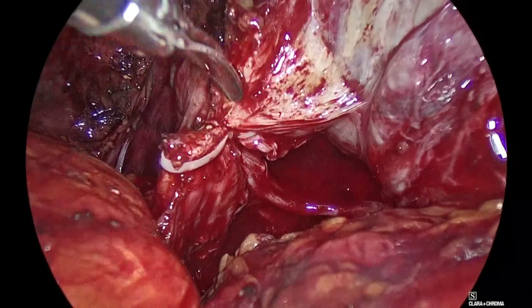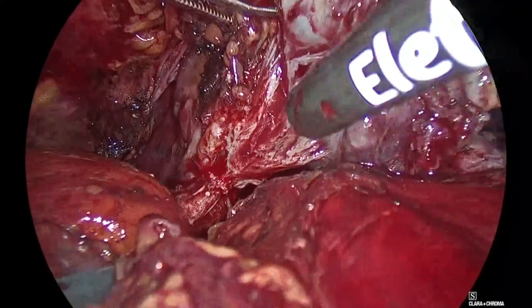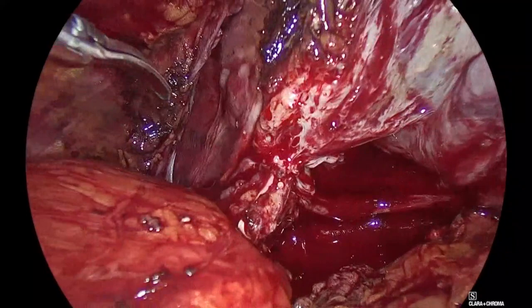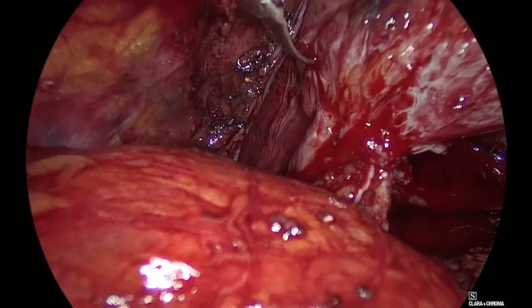Any comments, please feel free. Anything you want more, just clarify. Aspirate, Panagiotis, in there. Good, bring it down again. Padeli, come on my side here, left side. Just make a small cut here so it will facilitate my sliding down of the pedicle. Good. Clip.